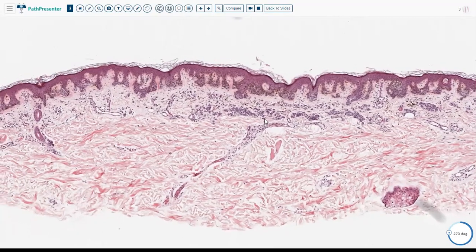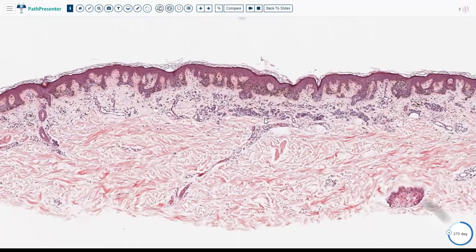When we say mild, moderate, or severe in terms of pathology, as dermatopathologists we're just trying to tell the clinician how concerned we are, or how confident we are that this is a nevus. For example, when I say this is a mildly dysplastic nevus, I usually mean that I'm really confident and willing to risk my career, or in other words, I'm not risking the patient's health, because I'm pretty sure that the patient has a mildly dysplastic nevus, a benign nevus, and there's nothing needed to be done.